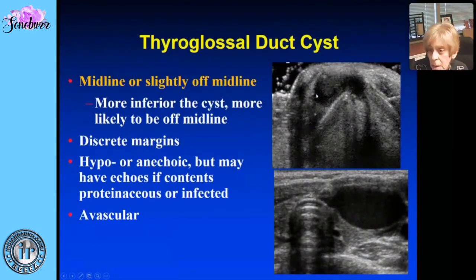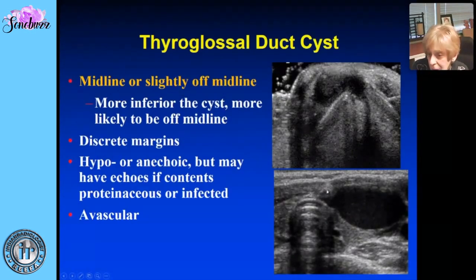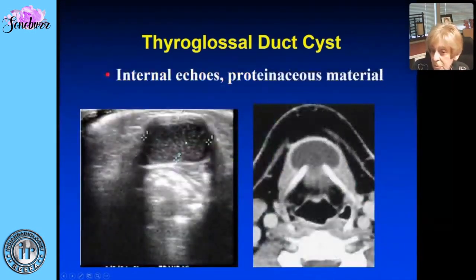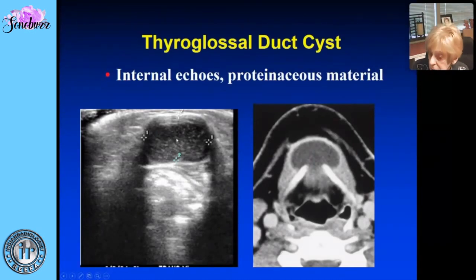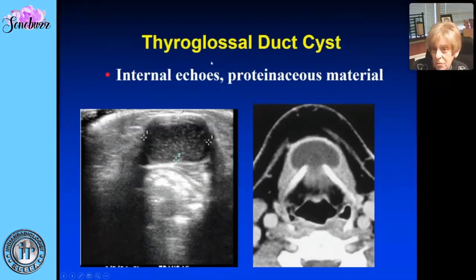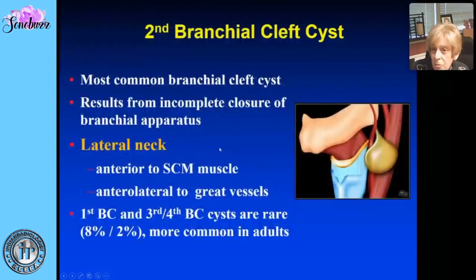Here is the hyoid bone with the midline cystic mass — that's the thyroglossal duct cyst. Lower down, at about the level of the thyroid, here's a cyst that's slightly off midline. You can see echoes within it — this doesn't necessarily mean it's infected; it can be proteinaceous material. And here's the CT showing the midline cystic lesion that's classic for thyroglossal duct cyst.